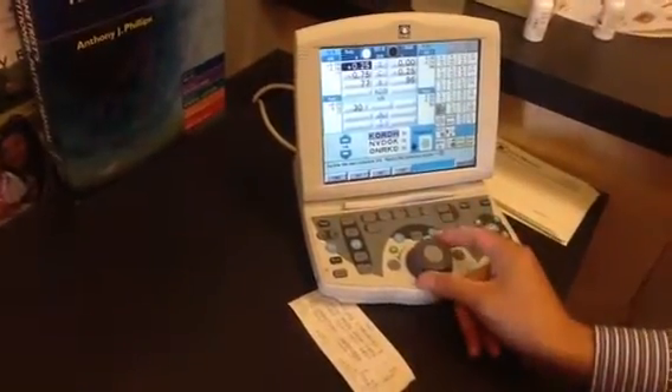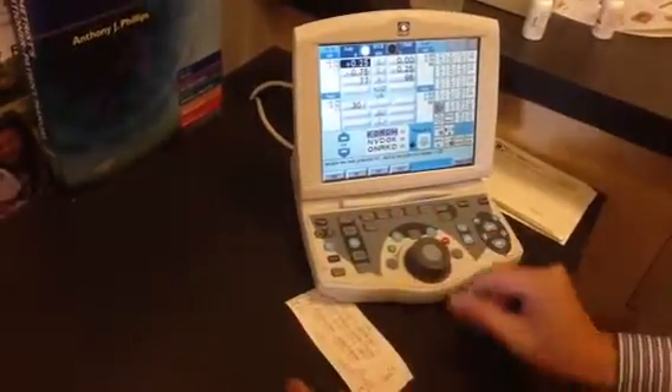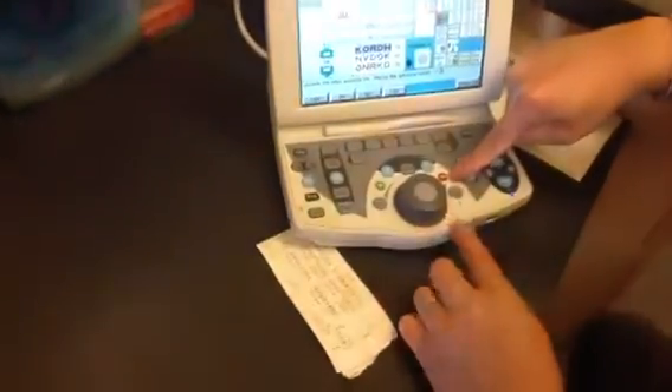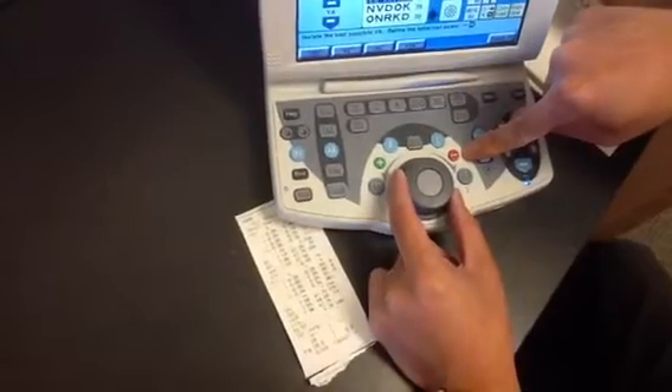With this knob here, I can adjust the power. If you see the negative here — if I turn right, it'll be adding minus. If I turn left, it'll be a plus. That is how you do the refraction for the sphericals — minus and plus.